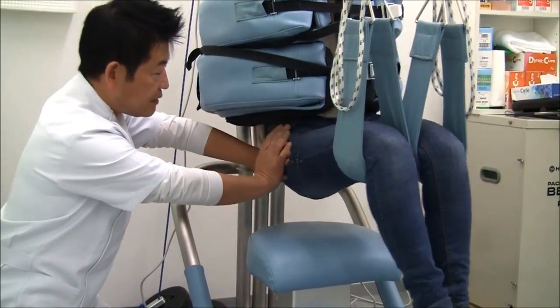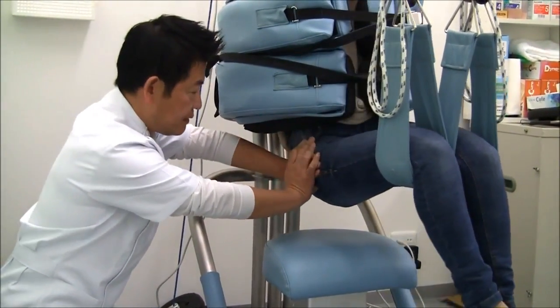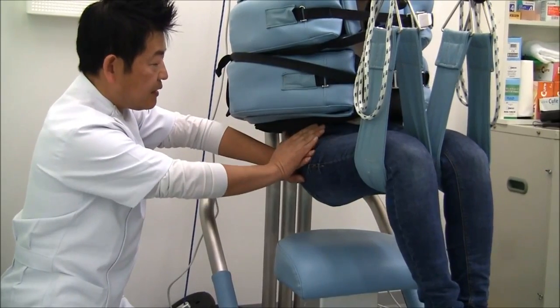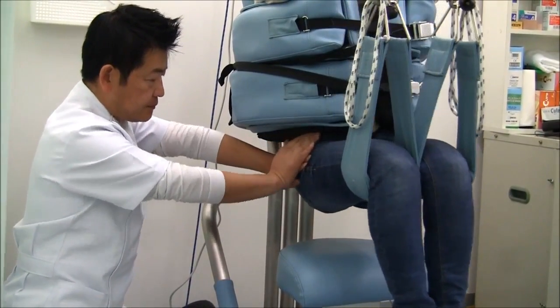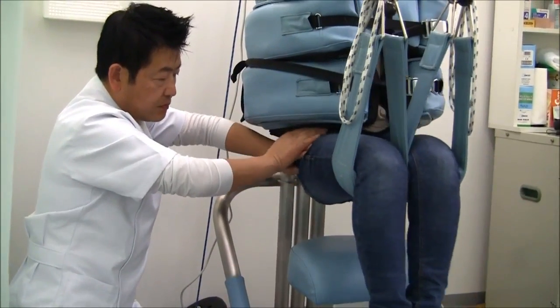Chapter 15. Pelvic Stretch. Push the hip left to right while the patient is resisting in a neutral position. Next, have the patient slightly rotate about 45 degrees and apply similar force. Change position and do the same on the opposite side.